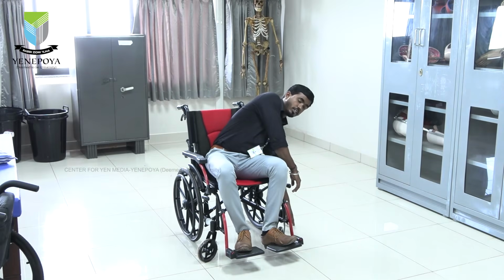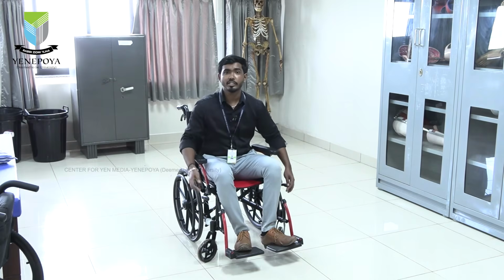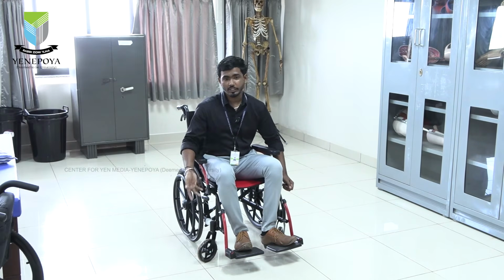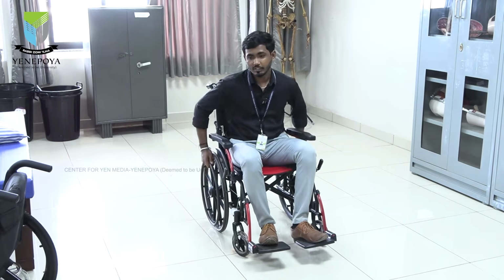So if you are doing this one, this opposite side is getting relieved now. Like this we have to go for like 15 to 20 seconds so that the pressure is getting relieved, so that the person can be there and do their works in their wheelchair for so long. Now we are going towards little bit intermediate level kind of things.